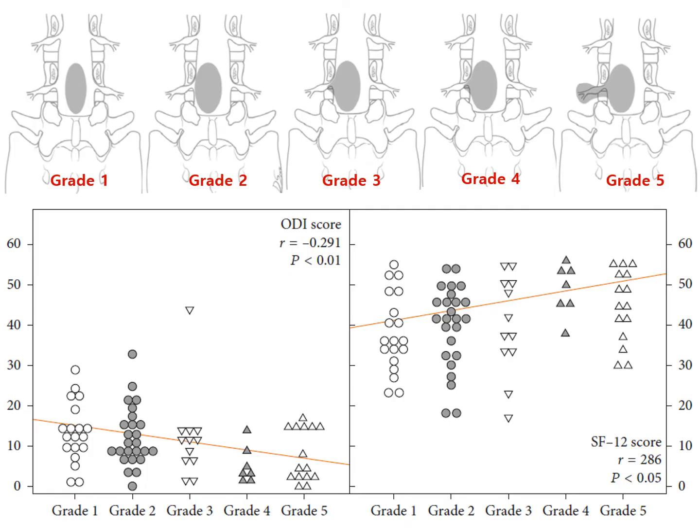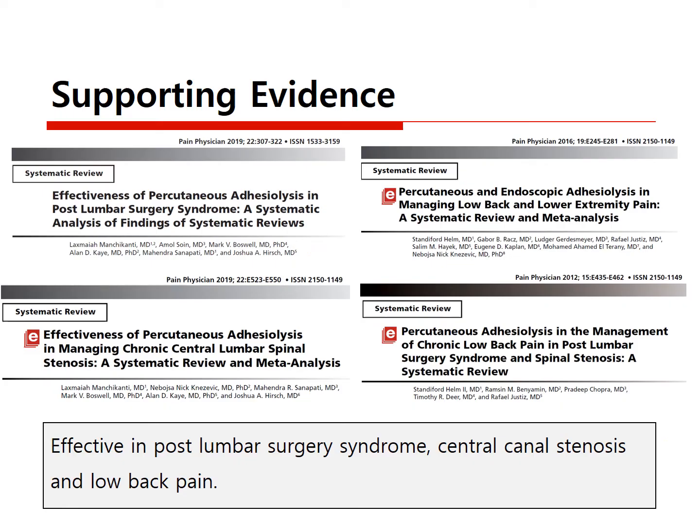As you can see in these figures, the more extraforaminal spread, the better clinical outcomes in ODI score and SF12 score were found.